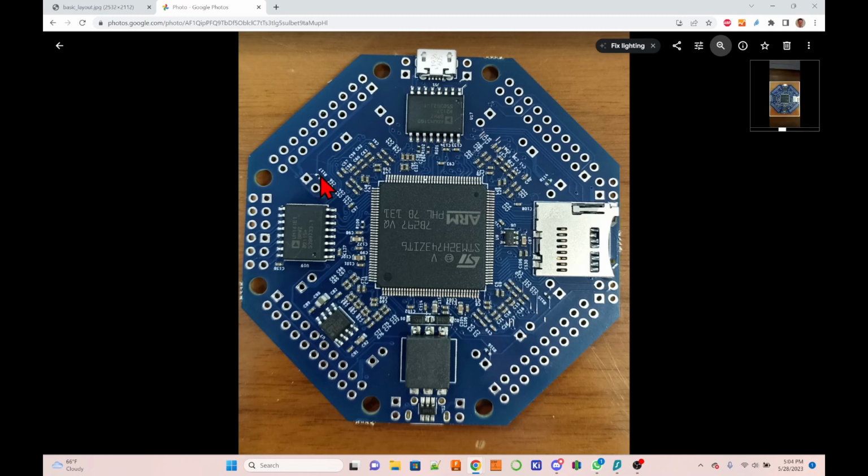And that little resistor is here. And what this resistor does, it's called a 0 ohm, so it has no resistance. It's basically a wire. And that connects these 2 pads directly. So this little one here needs to be removed. And there's another one over here, which connects these 2 pins, interconnects these 2 positions. There's another one over here, which interconnects these 2 positions. And then there's a 0 ohm resistor here, which connects these 2 positions. So those 4 0 ohm resistors have to be desoldered.